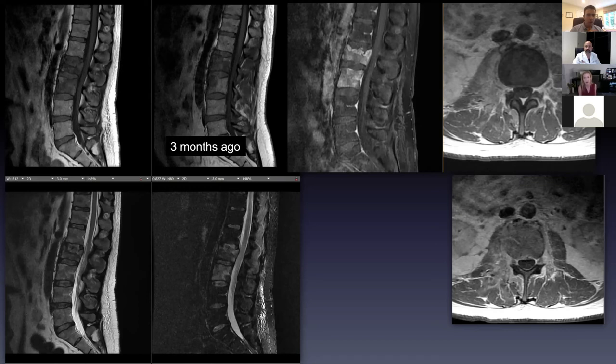I think people in the audience know that there is discitis osteomyelitis here. That's what it looks like, right? I don't think so, no. I think the preservation of the disc space actually argues against it. So I would be worried about an underlying oncologic process here, perhaps. That is very good, because that's exactly what I said to the infectious disease doctor when I talked to him. I said, are you sure this isn't cancer? And he said, yes, he's been worked up extensively. There is no cancer.